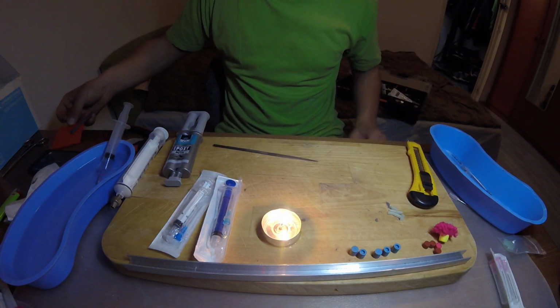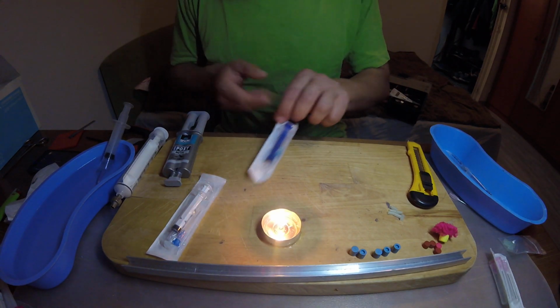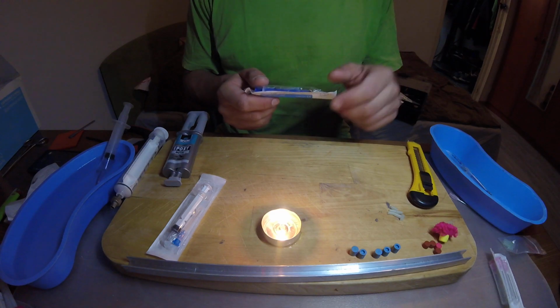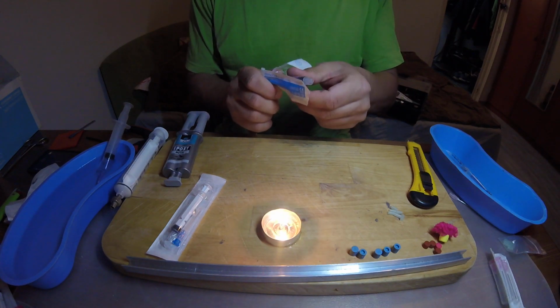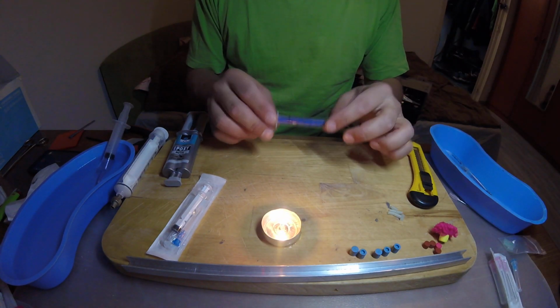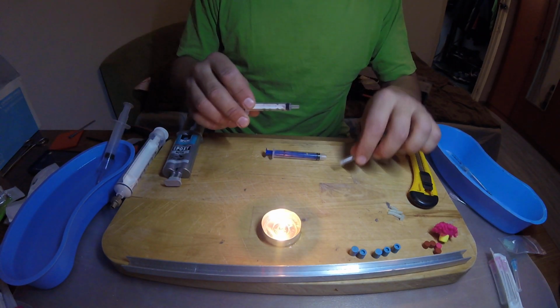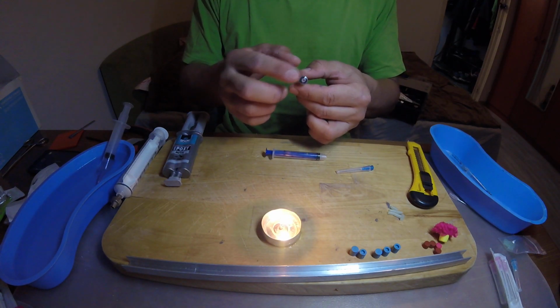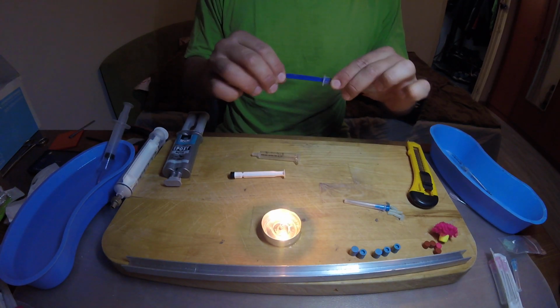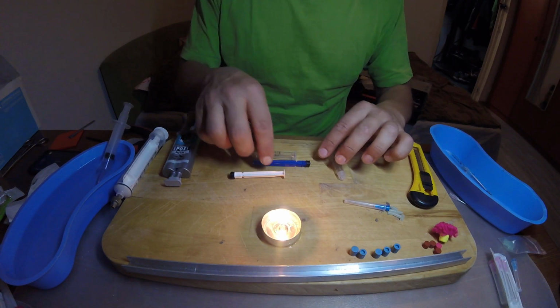Next, what we are gonna do is to build the darts. What we use is the chamber of the darts, the double chamber darts. We use this 3 milliliter luer lock syringe, yes, luer lock, and what I like to use is also a 2 milliliter syringe, the one that doesn't have the luer lock, so it's relatively different, because here we are gonna stick the needle, and here we are gonna stick the stabilizers.